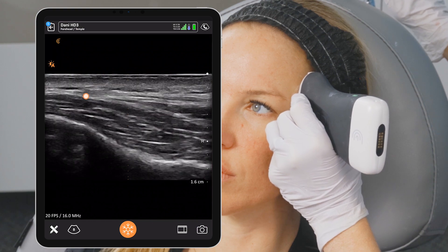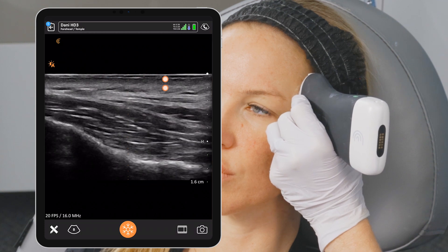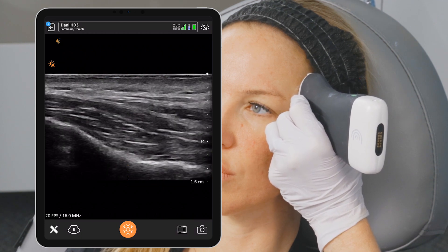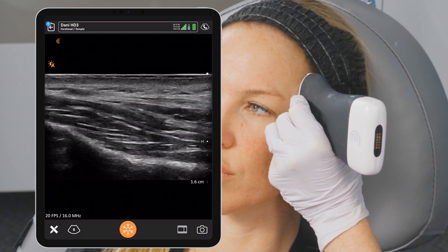In your mind's eye, you're going to be visualizing the cannula going into the layer right above the artery — layer 2. There's our layer 3, pulsatile on B-mode, you can still see it pulsating, and then we're going to be in layer 2 above it.